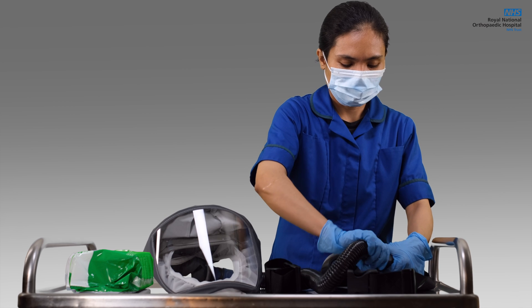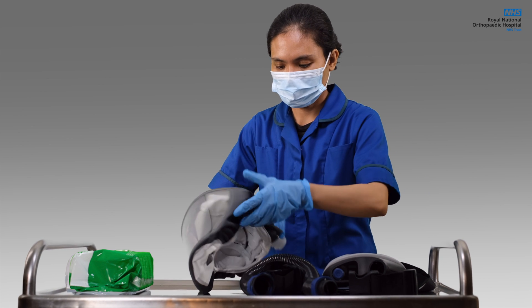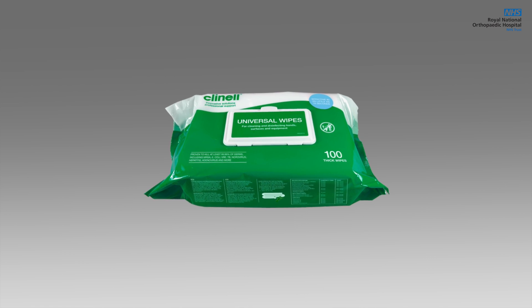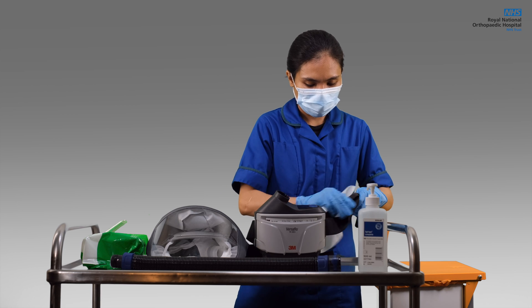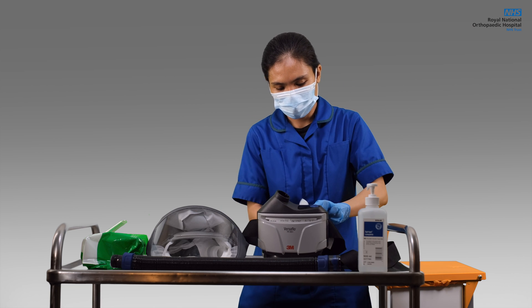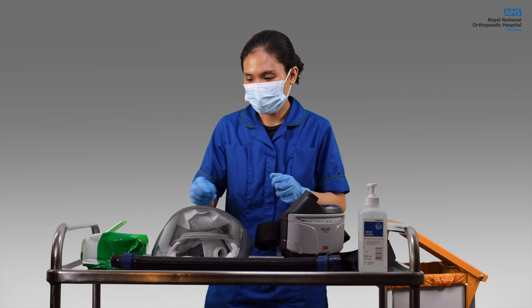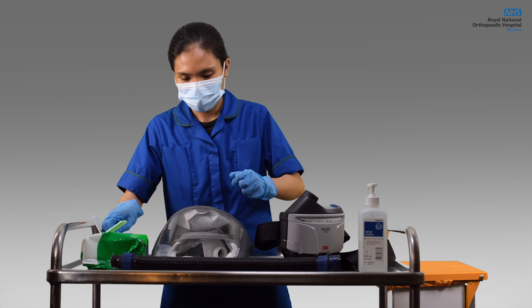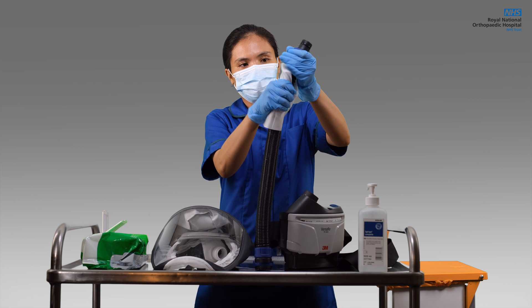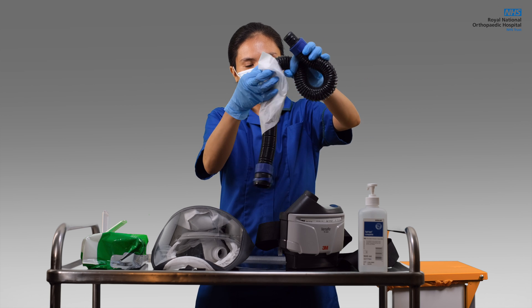Disconnect the hood, hose, belt, and unit for proper decontamination. Make sure you have ample Clenol Universal Wipes within arm's reach when decontaminating. First, wipe the belt, the hose, and the unit, then set it aside.